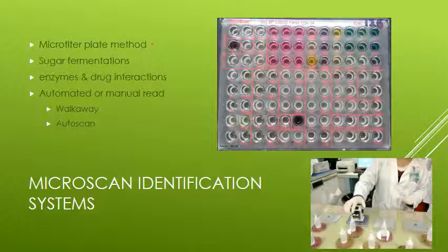No big thing, okay? You've got all your sugar fermentations, and you can see those here in this box, and then we have our enzymes and our drug reactions. Here's all our enzymes in these boxes here, or most of our enzymes anyway. No, most of them are enzymes. And then our drug interactions. We've got the rest of the plate are drug interactions.